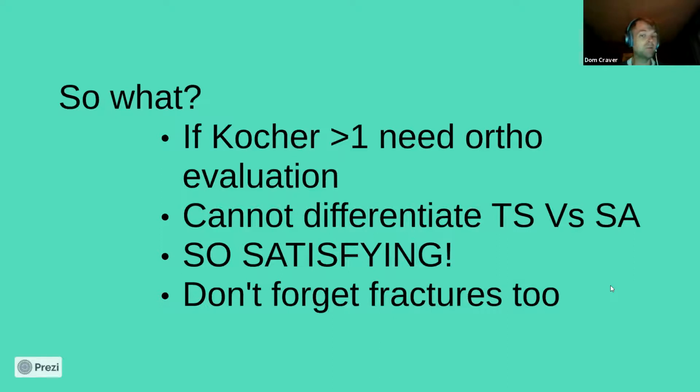Sometimes with those kids, you don't know why they're limping. You can't really work it out. Have a little scan, you find a bit of fluid. As I said, ultrasound's also really good for looking at fractures, but I haven't got any saved images of cases, so I didn't want to make it up.